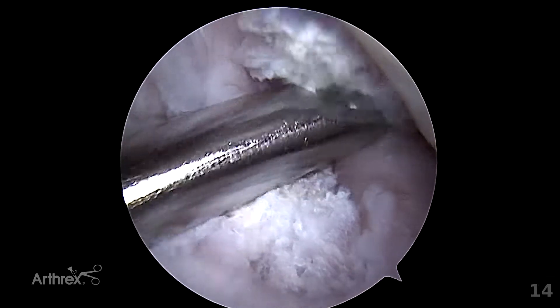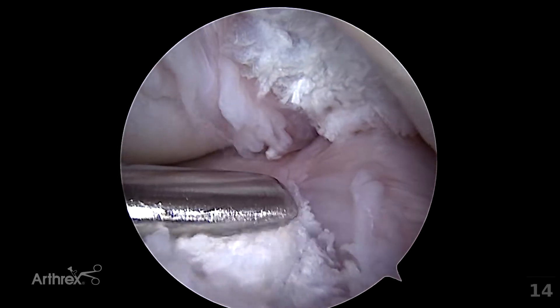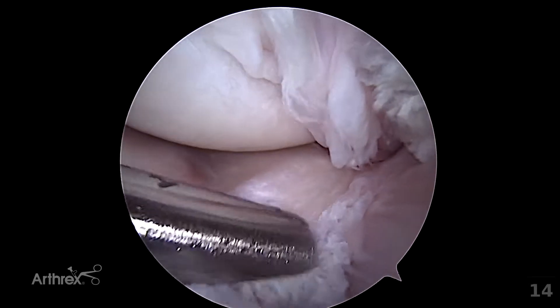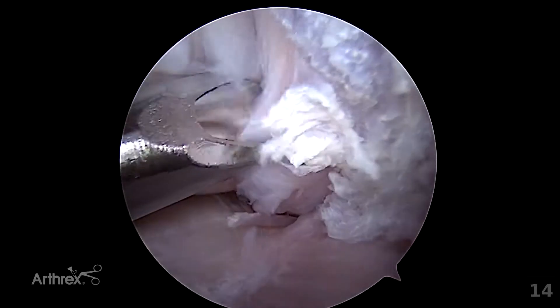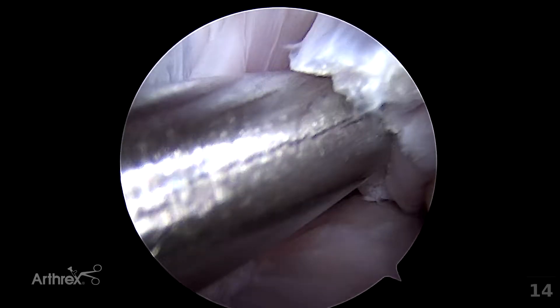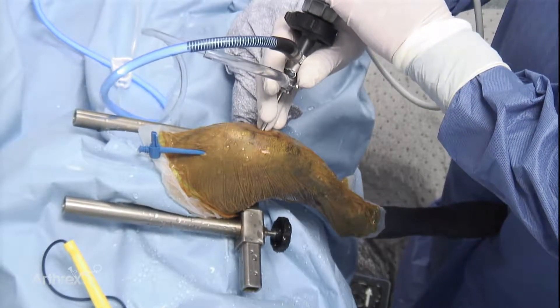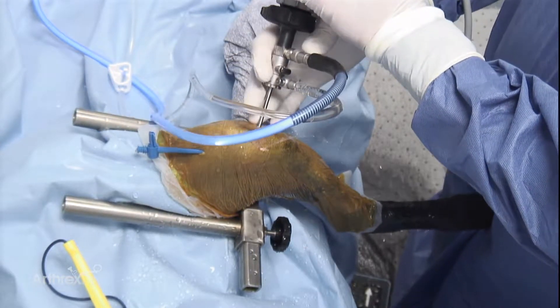The insertion of the cranial cruciate ligament is being debrided at this stage. Directly caudal to that insertion is the cranial ligament of the lateral meniscus — this ligament should not be damaged during this process. To the left of the shaver blade is the medial tibial plateau, which also should be protected. By placing the shaver up into the notch, the origin of the cranial cruciate ligament can be debrided. It is often helpful to place the four millimeter torpedo shaver at this stage to maximize visualization in this area.